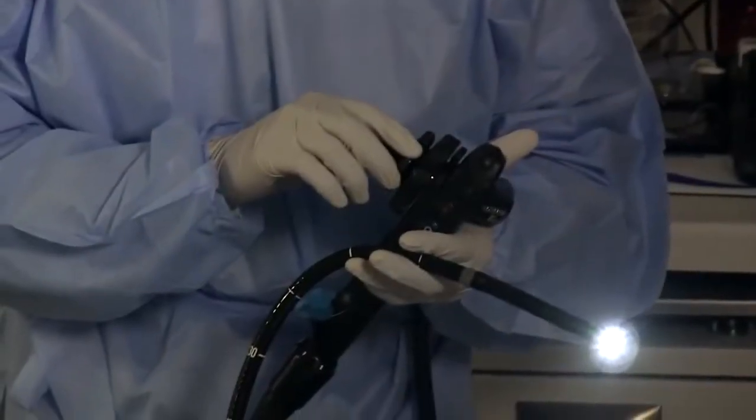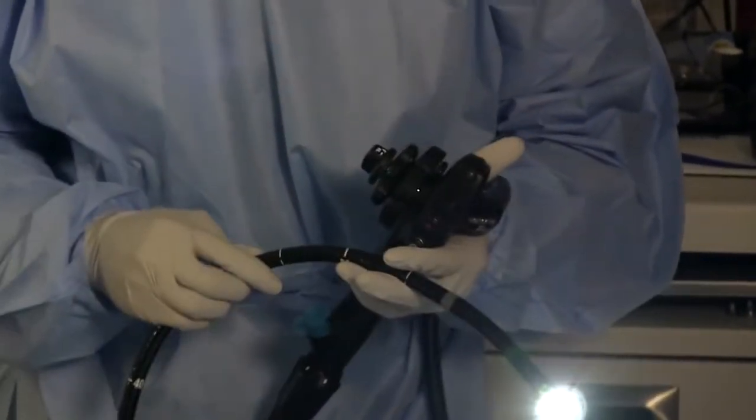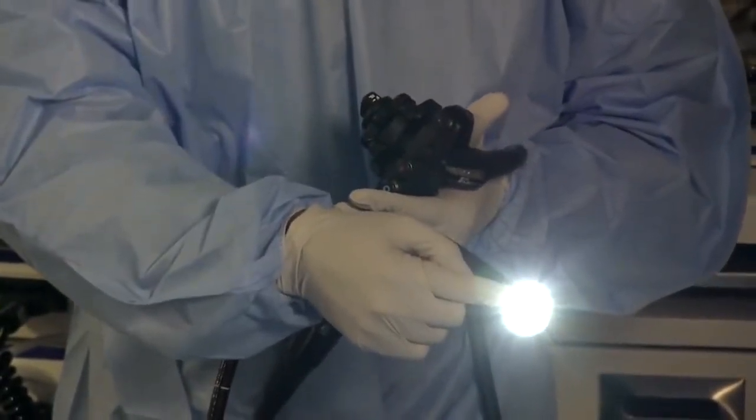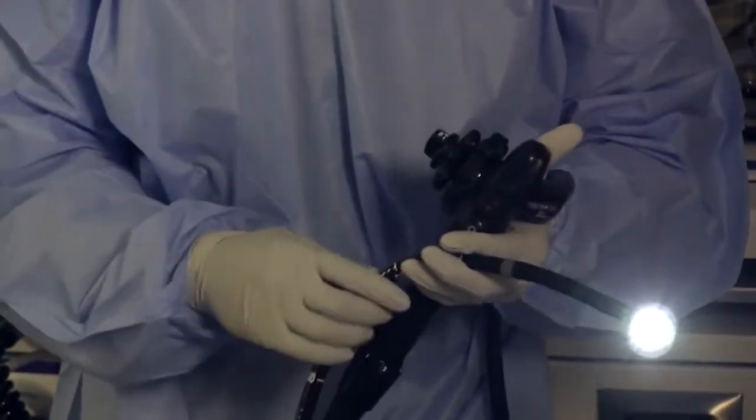For this exam, we use what's called a colonoscope. A colonoscope is a flexible instrument in which we can use knobs to turn both left and right, up and down, in order to examine the entire colon. This device also has a camera and a light on the tip that allows us to more thoroughly examine the colon and also to take pictures. Notably, your colon is approximately 160 centimeters, or 60 inches, or 5 feet, but we do not need to use 5 feet of scope because your colon is very compact inside your abdomen.